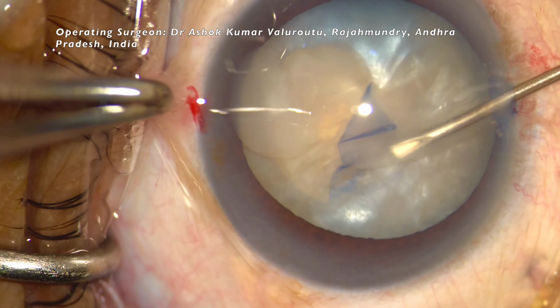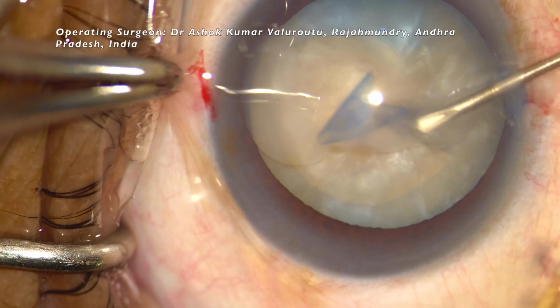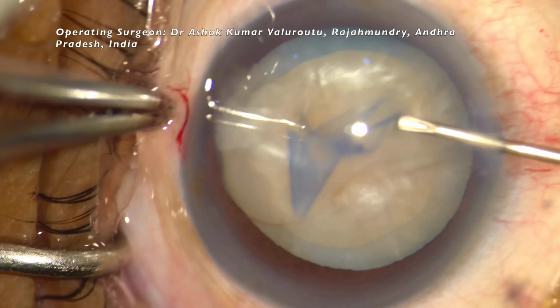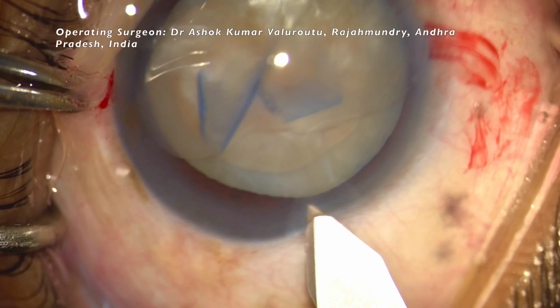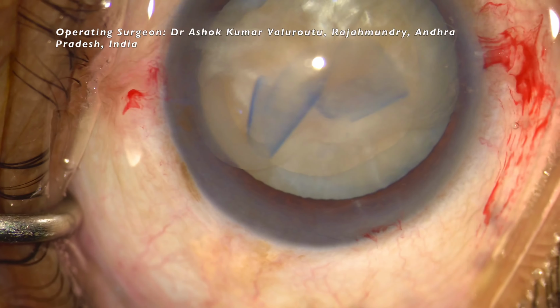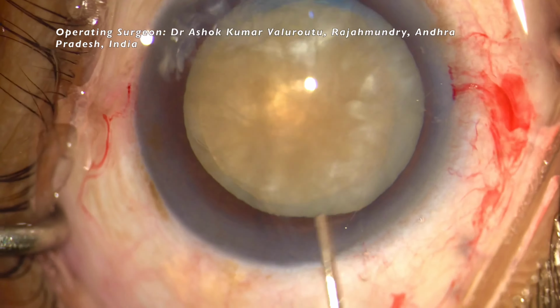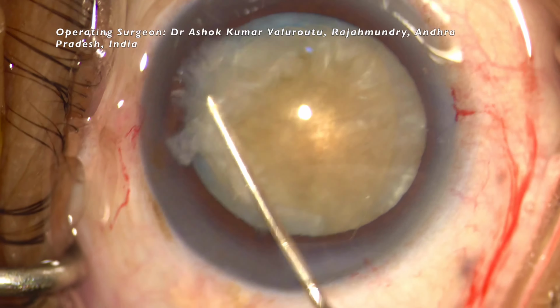Now we could see that continuous curvilinear capsulorhexis is done with a cystitome. Luckily I am able to do a CCC with a cystitome without the need for any Argentinian flag. This is the main key to proceed to phaco. If it is not possible, it is advised and better to convert the case into an SICS.